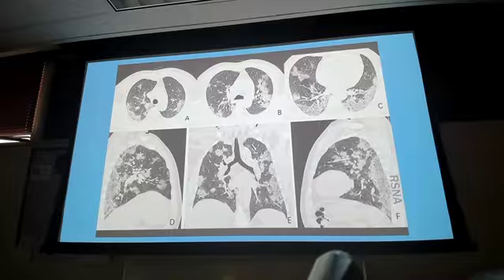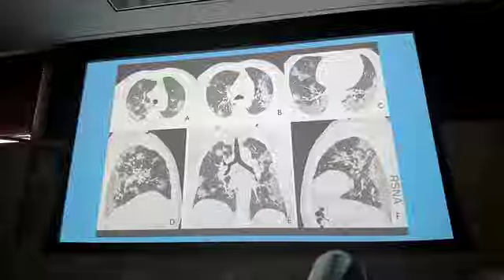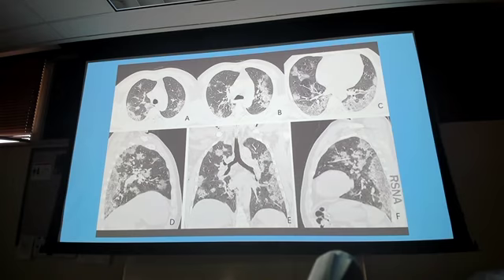This particular case is, I think, a post-acute COVID patient. So this is what COVID did to somebody's lungs. Just from generalities right now, I will tell you, all of the bright white in the lungs is bad news, right? It could be fluid, it could be collapsing of lung tissue, but all of this is inflammation, damage from COVID, and a COVID pneumonia. I don't remember if this is an acute phase or if the symptoms had gone away and this was afterwards because they were still having symptoms.